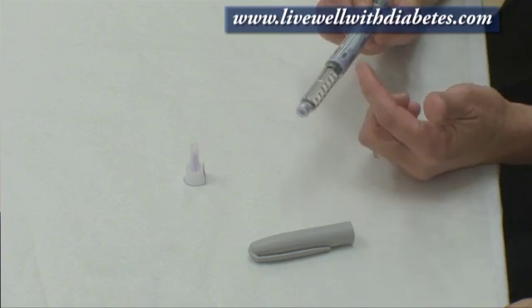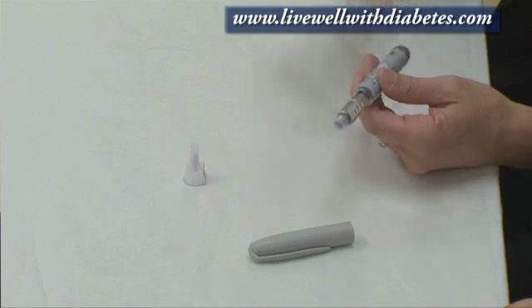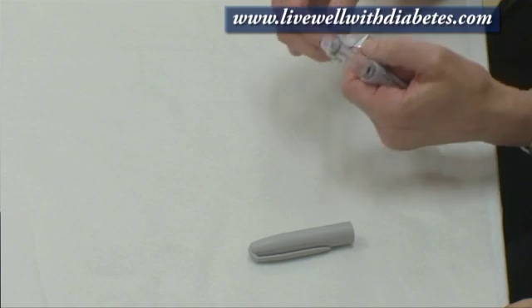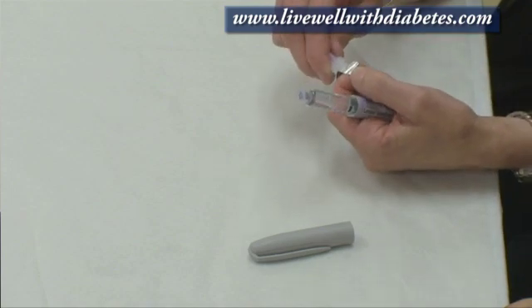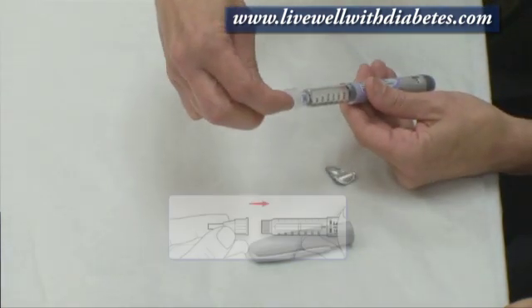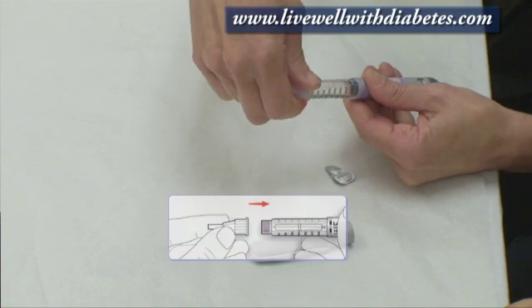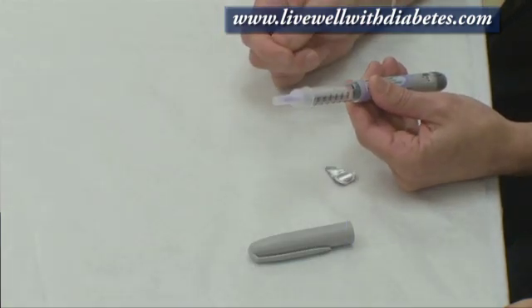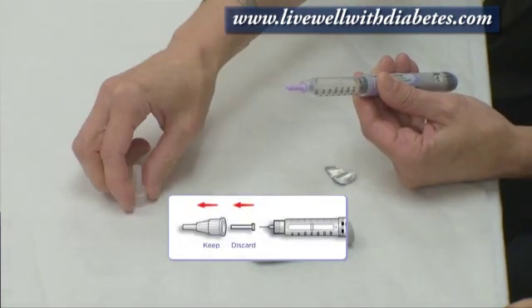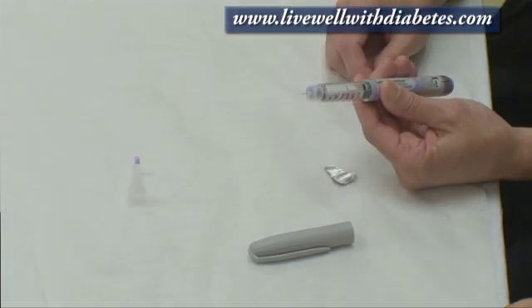Each pen already comes with 300 units of insulin in it. When you're ready to use a new pen, you take a needle — each needle comes with a piece of paper on it. You pull the piece of paper off, then you screw the needle onto the end of the pen. Each pen needle comes with two caps: pull the outside cap off and then pull the inside cap off, and there's the needle.